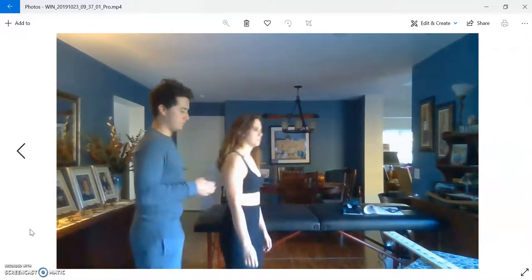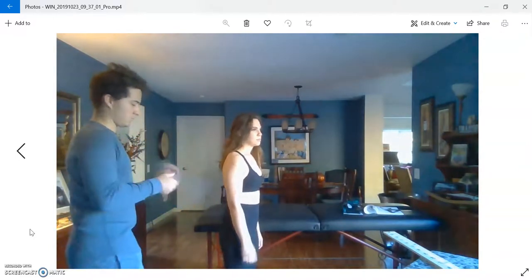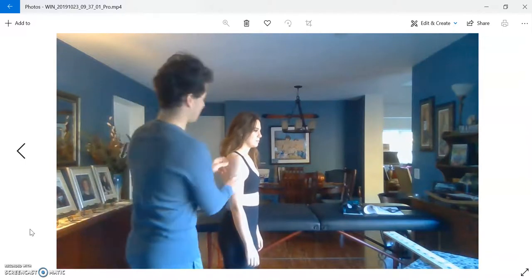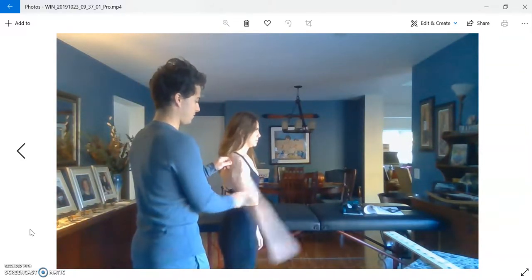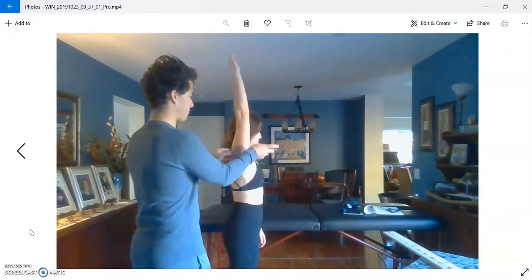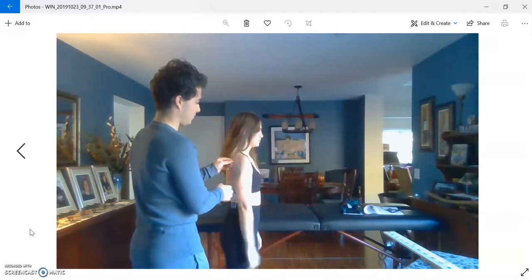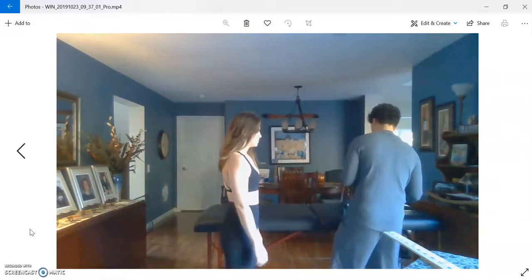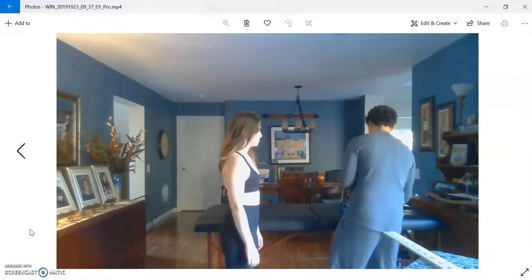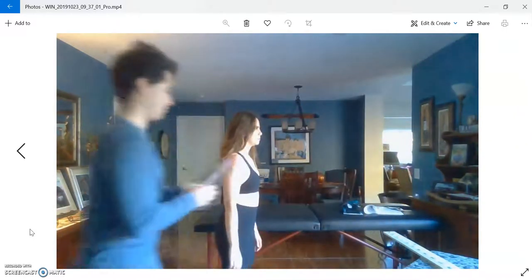Next, we move into flexibility assessment, where we use the goniometer. First, we begin with shoulder flexion, where she is standing this time, as opposed to being in a supine position, and starting the goniometer at the acromion process. Recording the results. Next, we move into shoulder extension.